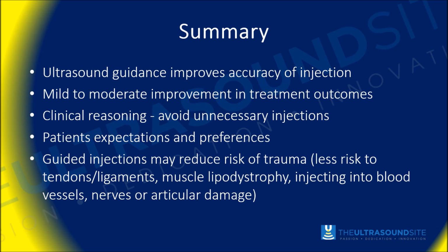So we know that we injected into that knee or into that bursa, so if they don't get a benefit, we might be that much less inclined to repeat the injection, because we know there's not an accuracy issue. We know that it wasn't a question that the needle just didn't quite go in the right place. And again, in terms of reassuring the patient that the treatment went to the right place.